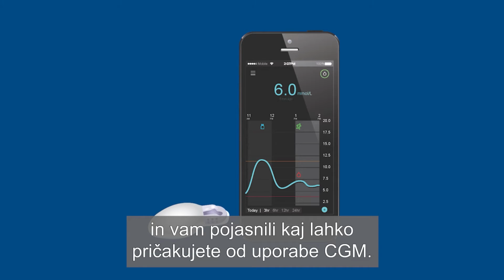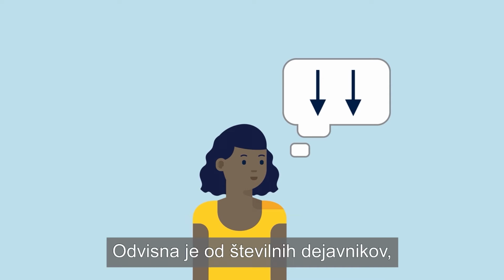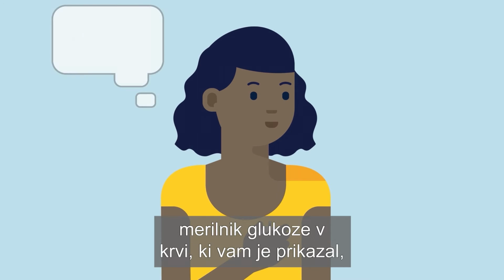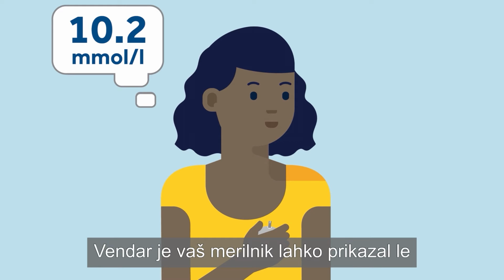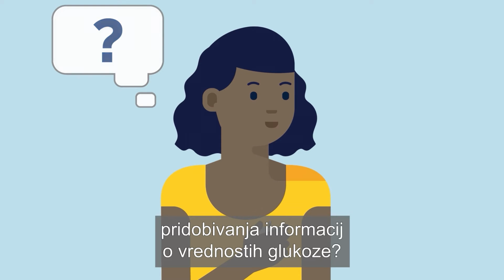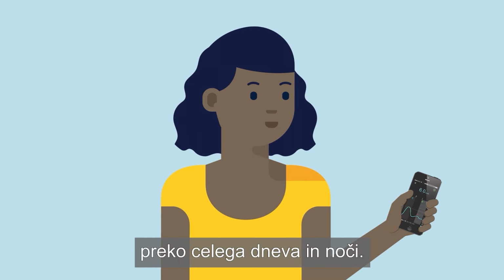when using CGM. Your glucose value constantly changes, going up and down depending on many factors, such as food, insulin, and exercise. And up until now, you have used your blood glucose meter to tell you what your glucose value is. However, your meter can only tell you what your glucose is for that moment. What if there was another way to get information about your glucose levels? Well, CGM gives you a way to see what your glucose levels are throughout the day and night.